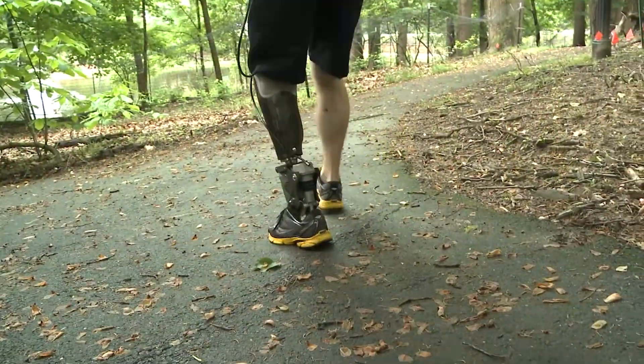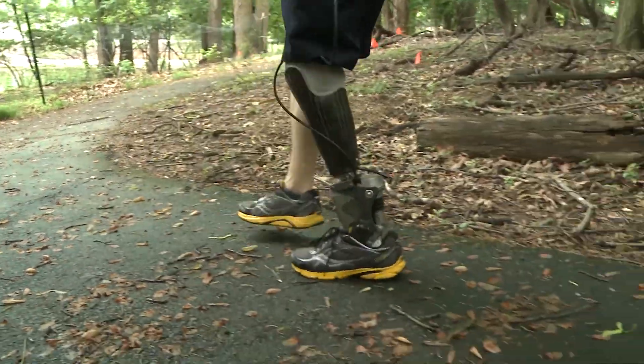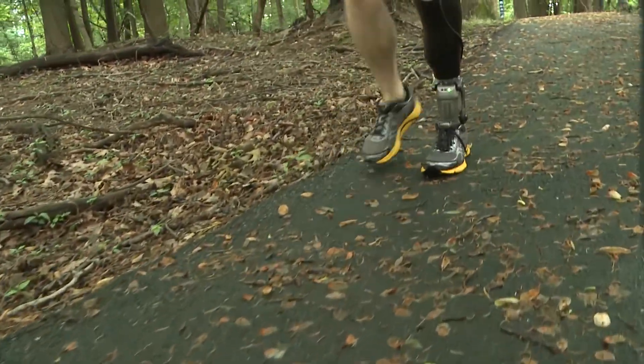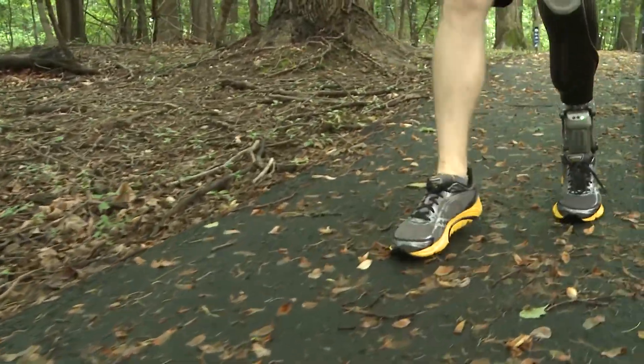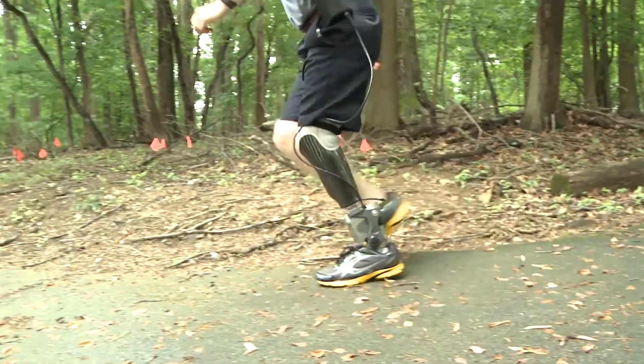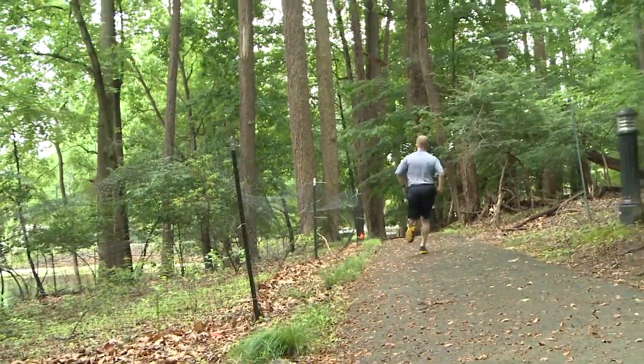We even found that it can walk backwards fairly well — it sort of reaches back for the step as you go. We're experimenting with lots of different other types of control activities as well, but where we're at right now is pretty smooth transitions as the speed increases and from walking to running.